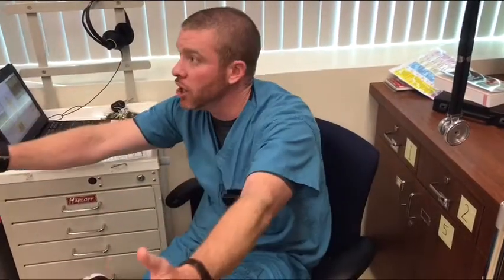Say you had to go up on your volumes or your pressures, and you finally got an adequate tidal volume. Again, we have the established pneumoperitoneum. Now we've been doing the operation, fast forward 45 minutes, and that gallbladder's out. What are they going to do after the gallbladder's out? They're going to close up. Procedure's done. As they do that, they're going to take out the trocars and deflate the pneumoperitoneum. Meanwhile, you've been ventilating this patient with higher pressures to get the same volumes.